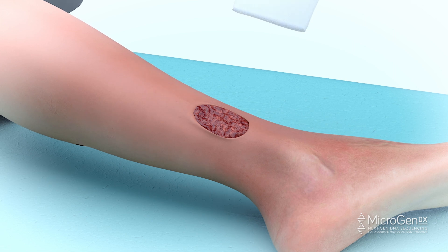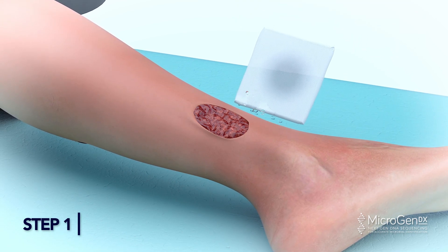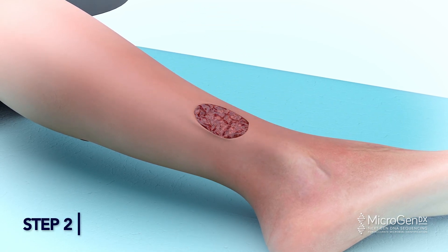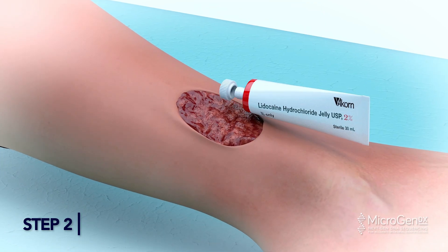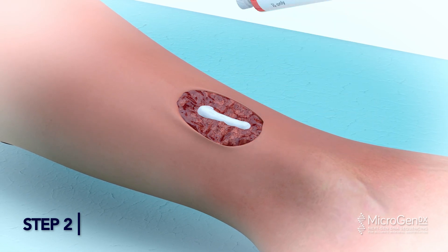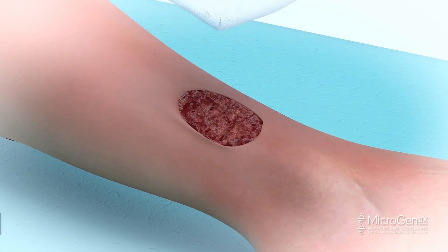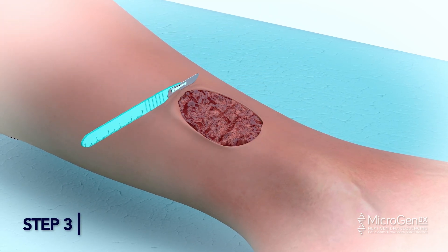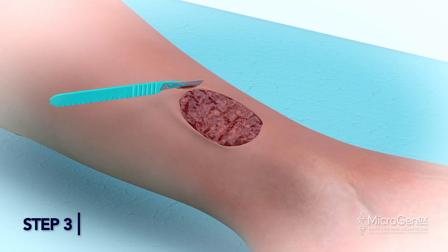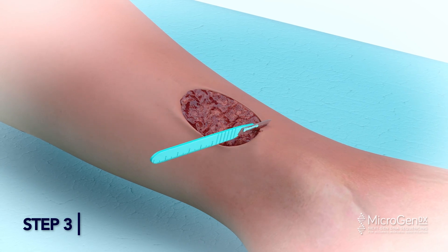Debridement Method. Step 1: Use gauze and saline to lightly wipe the surface area to remove slough. Step 2: For patient comfort, administer numbing agent when necessary. Wipe off all lidocaine gel with saline prior to taking sample. Step 3: Scrape down debris until there is a little bit of bleeding. Collect samples from all areas of the wound when possible to ensure a full and accurate sample.